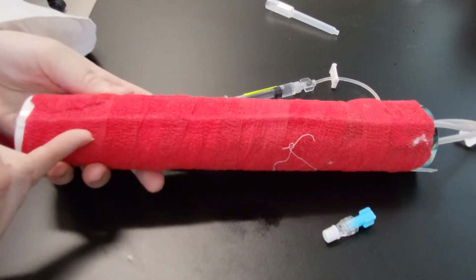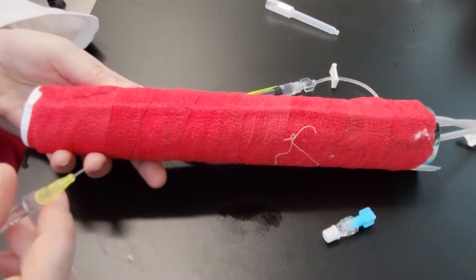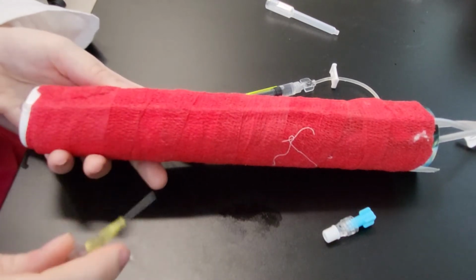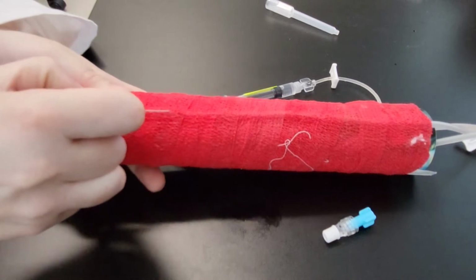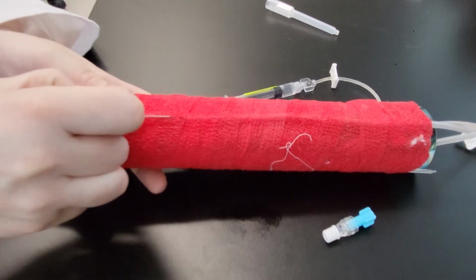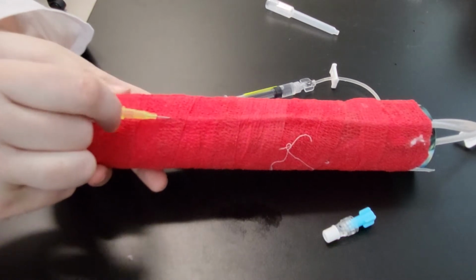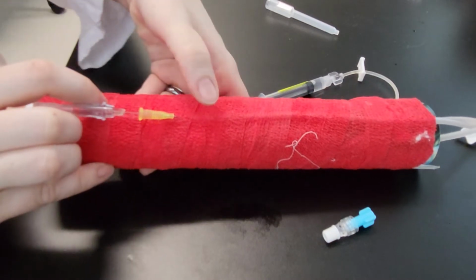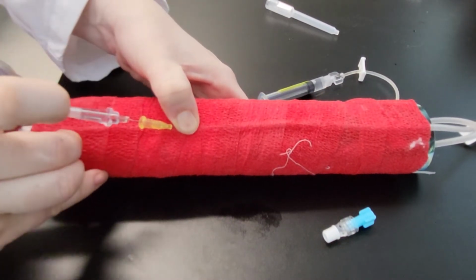So make sure to keep your thumb away from the area, and that is to make sure that we are following strict aseptic technique and not introducing any bacteria into the site. At this point, I'm going to go ahead and insert my IV catheter, bevel up as always, and then I'm going to advance the catheter. And now at this point, once you've advanced and we're situated here, I'm actually going to occlude the vessel, and then I'm going to pull my stylet out at that point.